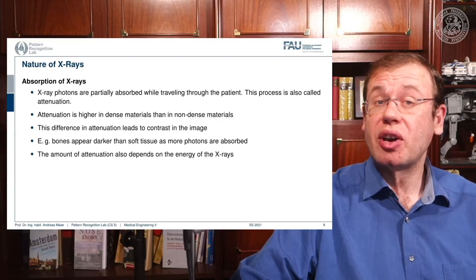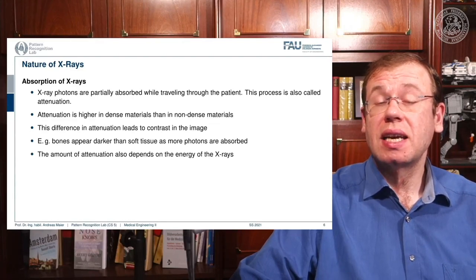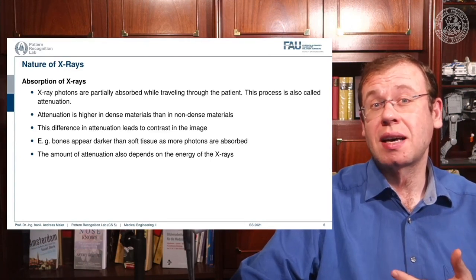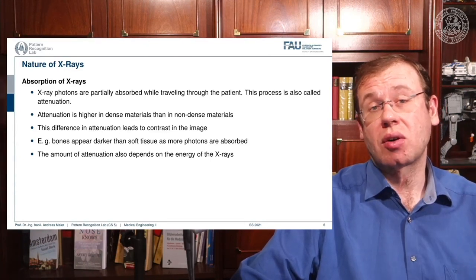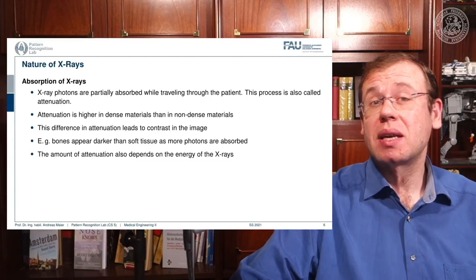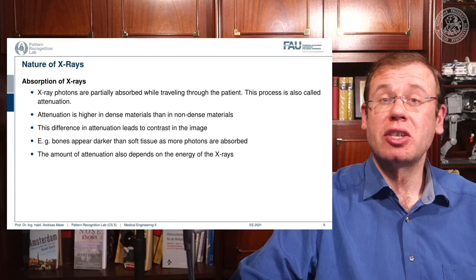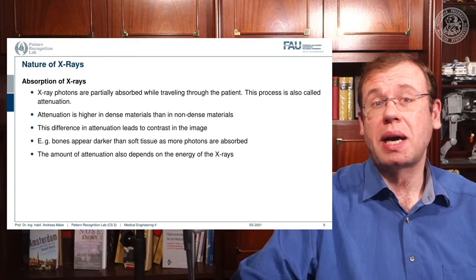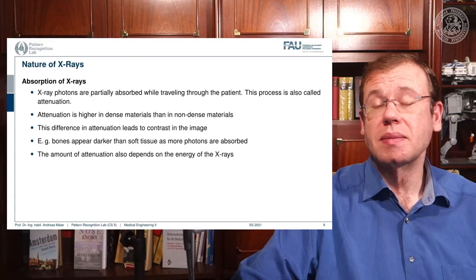So what you're effectively measuring with an X-ray is accumulation. You could say something similar to a sum of all of the objects along the path. It's slightly more difficult, but we'll see that in a bit. But for the time being, you can imagine that you essentially see a sum of everything that is along the path. And we will be able to describe that also in terms of physics in a couple of slides.